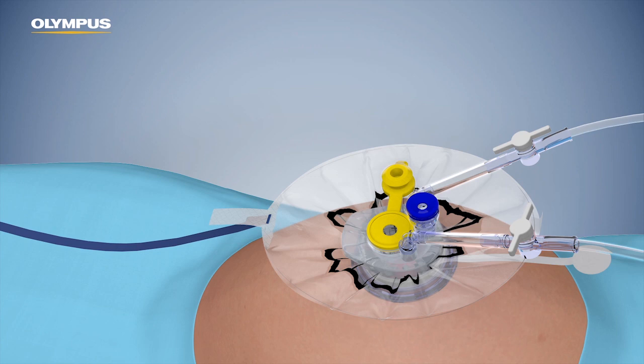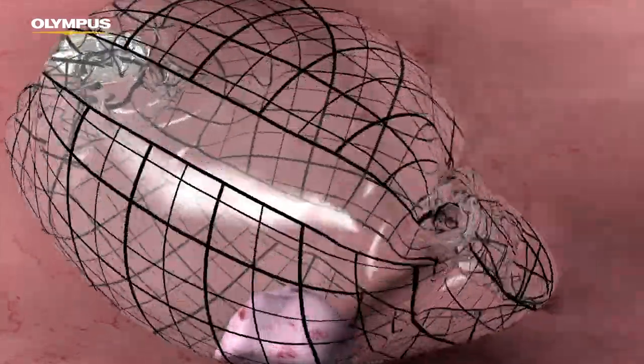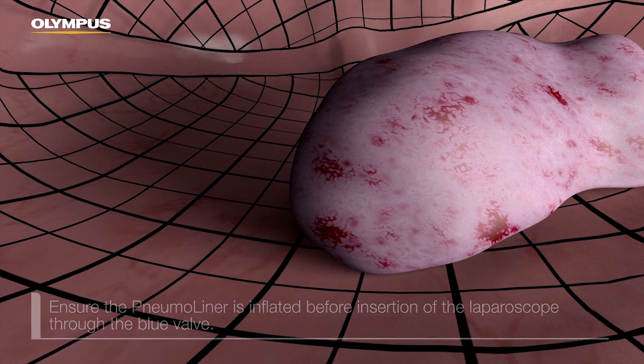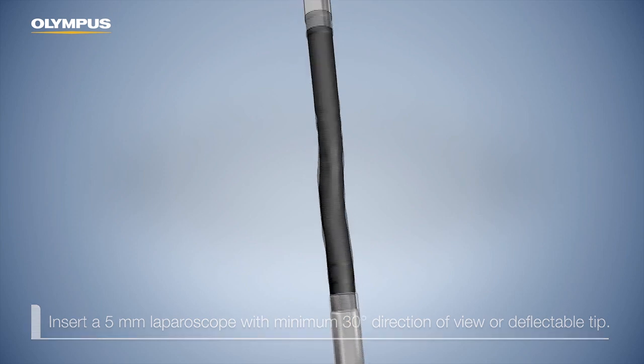Do not twist the boot while it is attached. Insufflate the pneumo liner to a pressure of 12 to 15 mmHg using the insufflation port. Ensure the pneumo liner is inflated before insertion of the laparoscope through the blue valve. Insert a 5 mm laparoscope with a minimum 30-degree direction of view or one with a deflectable tip.